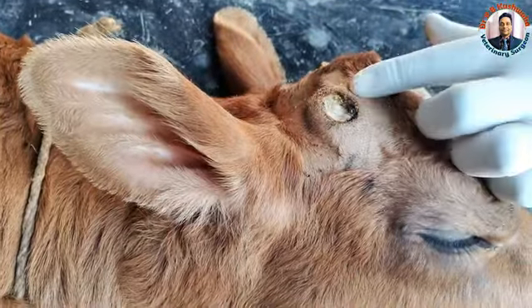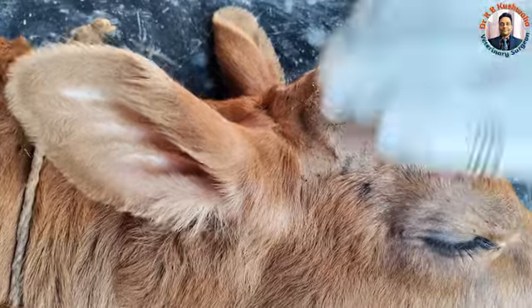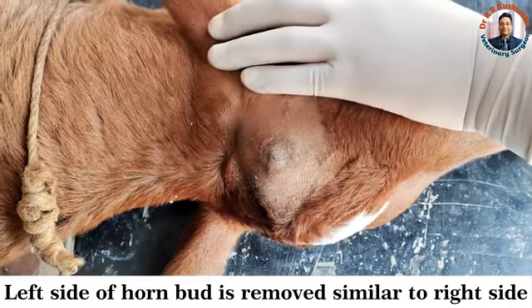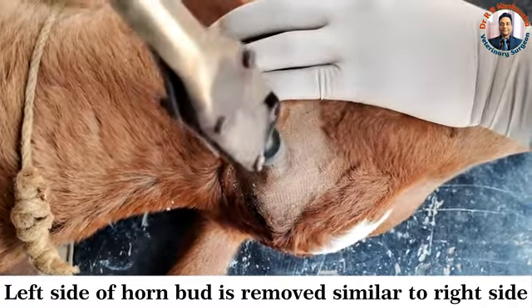Now you can see we have removed the bud. There is no bleeding or anything else. We have already removed the bud on the right side, so this is now the left side — same procedure.